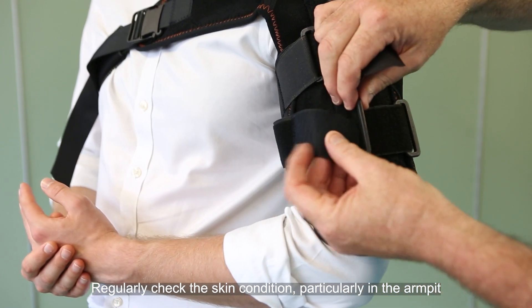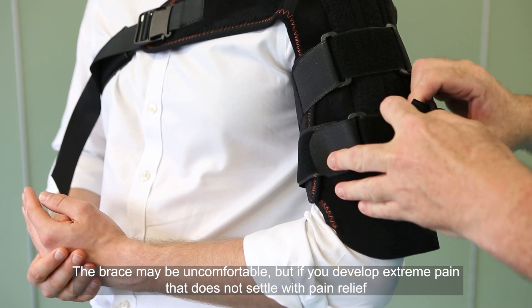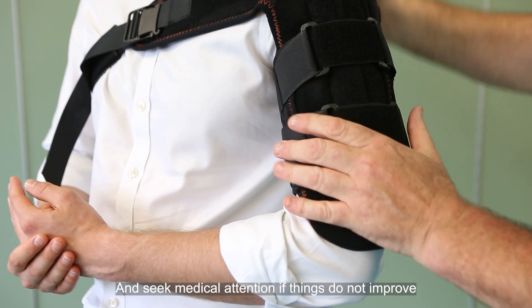Regularly check the skin condition, particularly in the armpit. The brace may be uncomfortable, but if you develop extreme pain that does not settle with pain relief, or develop tingling or numbness, check the brace is not too tight and seek medical attention if things do not improve.